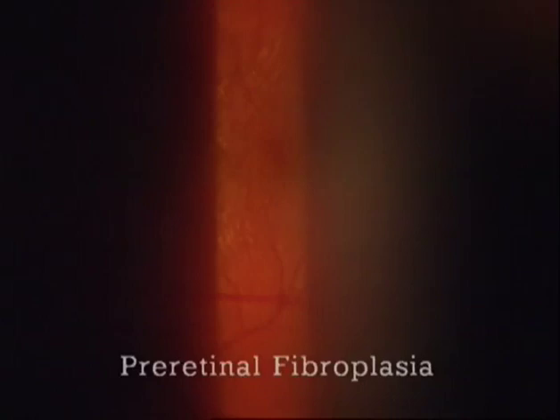In this normal eye, we see a very strong specular reflex at the anterior surface of the cornea, weaker reflexes at the posterior surface of the cornea, at the anterior surface of the lens, and at its posterior surface. In this case of pre-retinal fibroplasia, we see reflexes at the anterior surface of the retina.